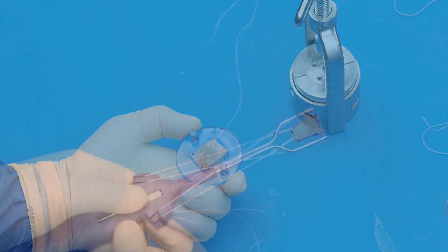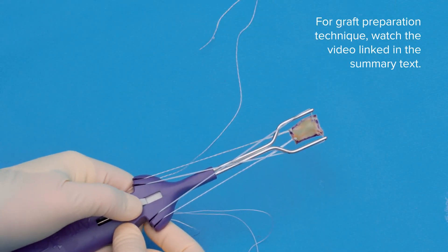The patch is beautifully formed. Now we have to just load it onto the introducer.